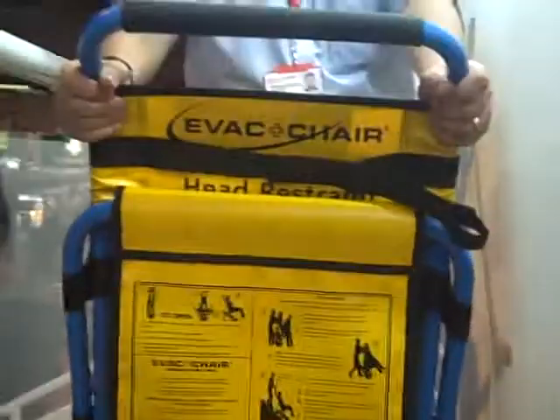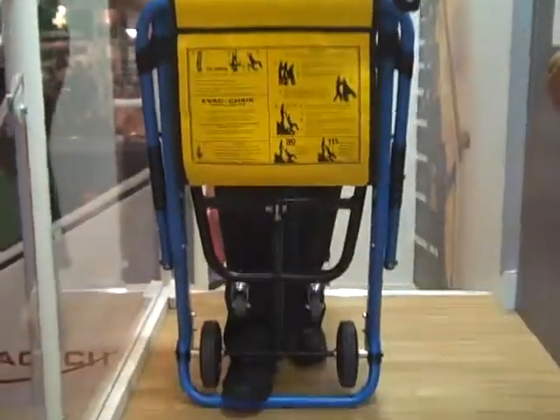Hi, I'm Cameron Chalmers from EVAC Chair, and this is the EVAC Chair. It's an emergency evacuation chair provided for the emergency evacuation of mobility impaired persons. I'm going to provide you with a demonstration using my colleague Diane here to show how to take someone down the stairs easily, without any effort.